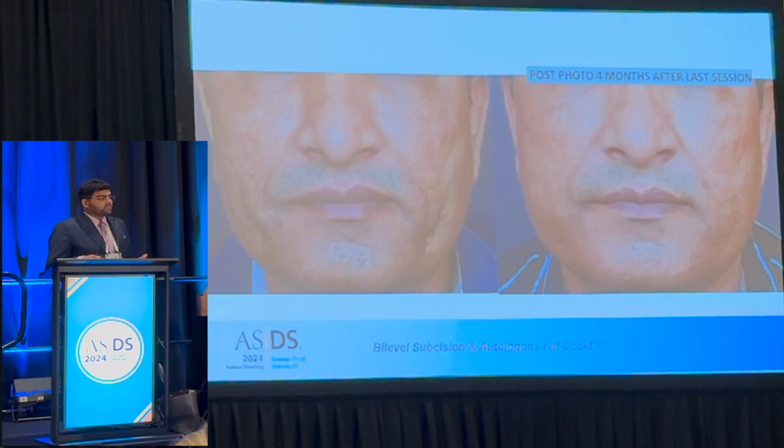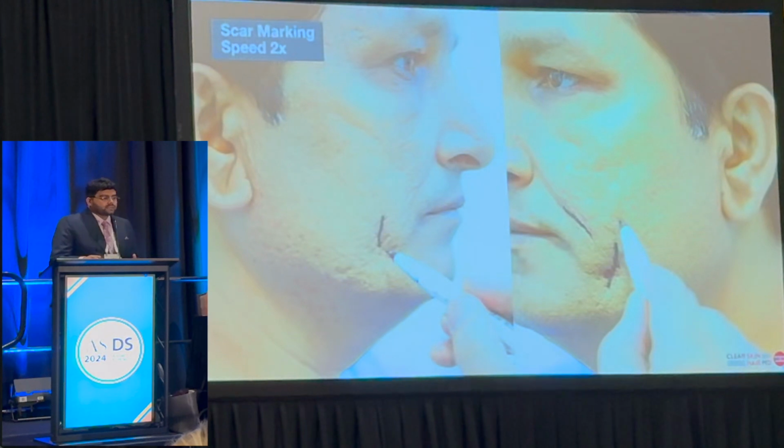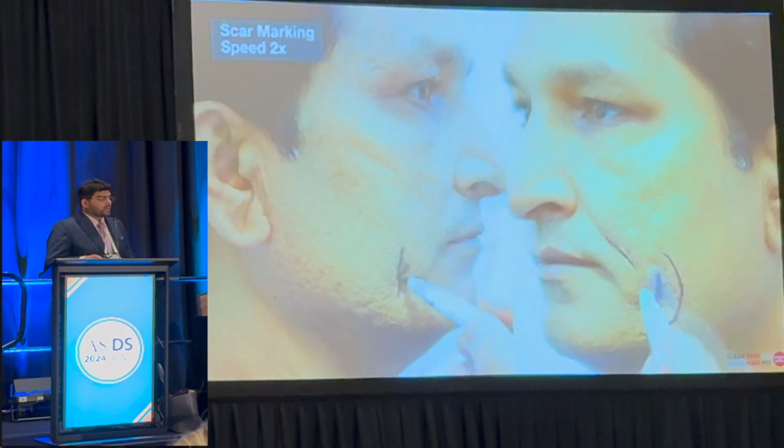And this is the case that I'm going to discuss today. We are each going to discuss one case. This particular patient had a lot of fat atrophy because of acne scars, topographical irregularities, and adhesions at the subcutaneous level. This is the video of the whole procedure, and I'm going to start playing it.